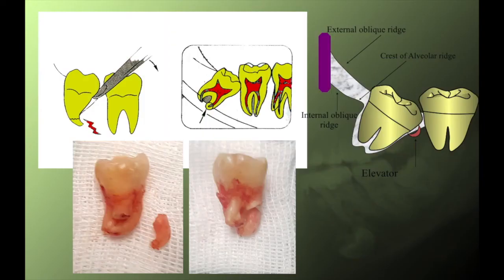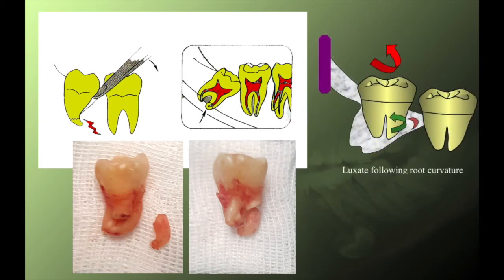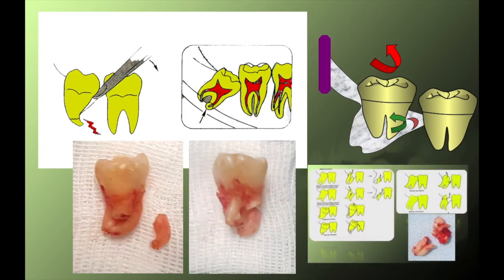Always have in mind that the direction of tooth delivery is always related to the movement and elevator mechanics that you will use. Move your instrument in one direction, and the tooth moves in that same direction. Go over the previous slide on root curvature if need be.